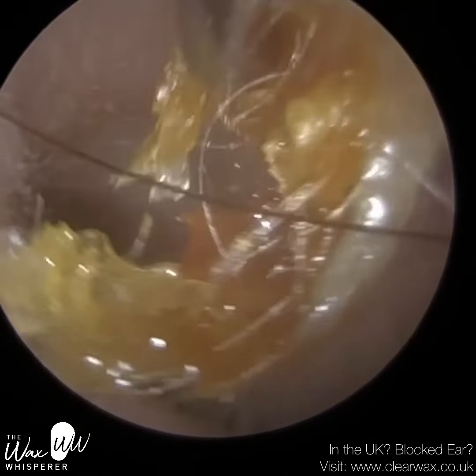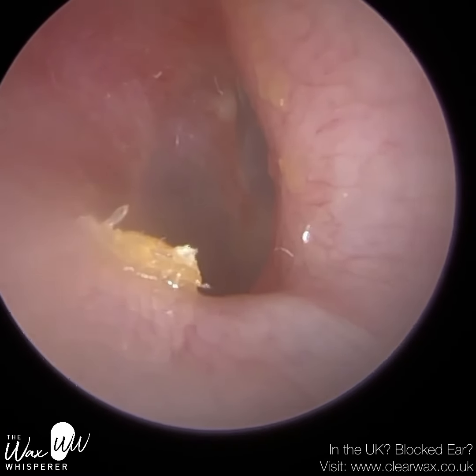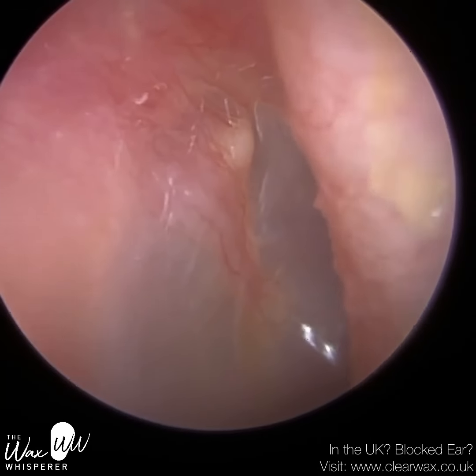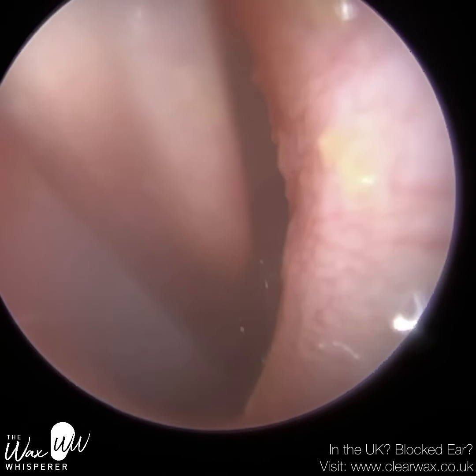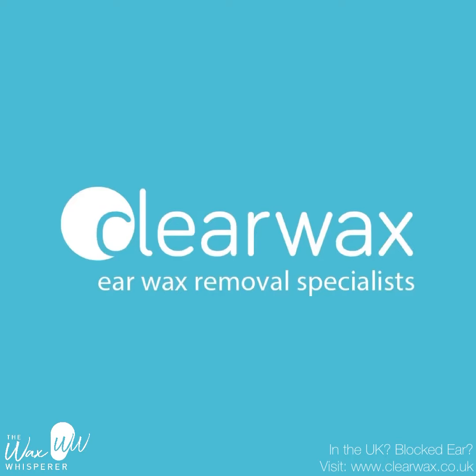So I'm just going to go back in and mop up some of this residual skin. You can see just how narrow this ear canal becomes — it really closes in and then widens back out again, and that's why the patient's having problems. There's a bit of oil trapped in the inferior recess; I just went in with a sucker to clear it out. The patient's really happy. Well, I hope you enjoyed that video, guys. Keep well, take care, and remember — be nice and be kind. Thanks, bye.